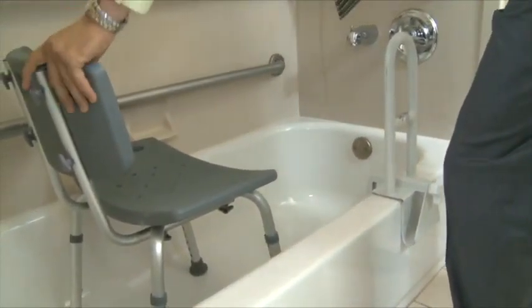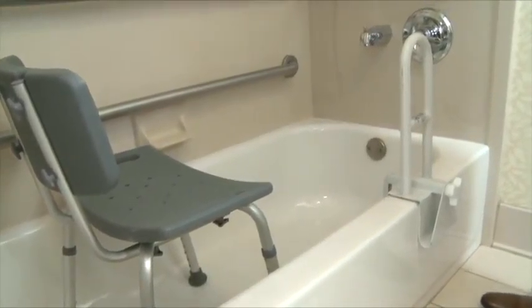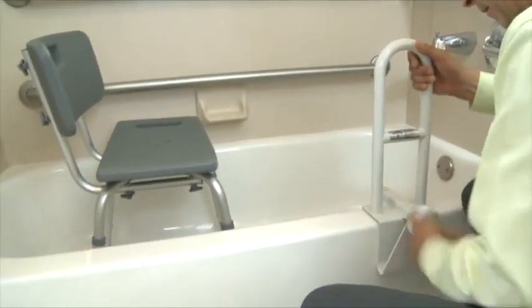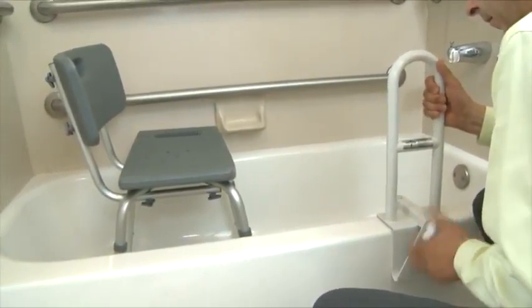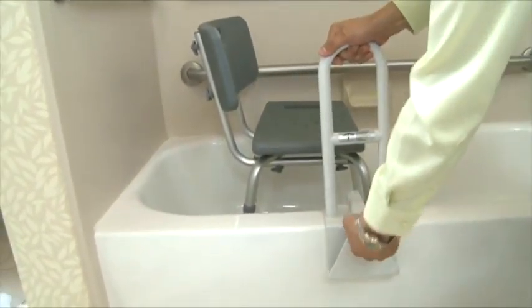The tub bar should be positioned midway between the front wall and the shower seat, leaving room to stand. Alternatively, the tub bar can be positioned midway along the tub threshold to be used as needed for a transfer assist.